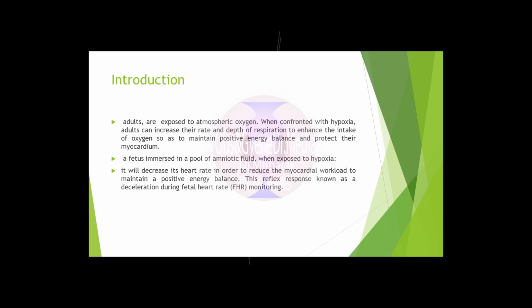In contrast, the fetus, when exposed to hypoxia, cannot increase its oxygen supply, and therefore it will decrease its heart rate in order to reduce the myocardial workload to maintain a positive energy balance. This reflex response to decrease the heart rate to protect the myocardium against hypoxic or mechanical stresses is heard as a deceleration during fetal heart rate monitoring.